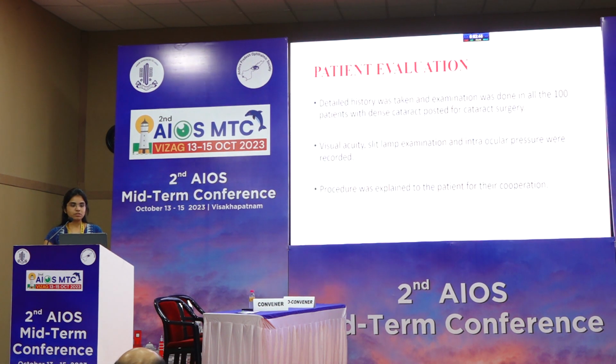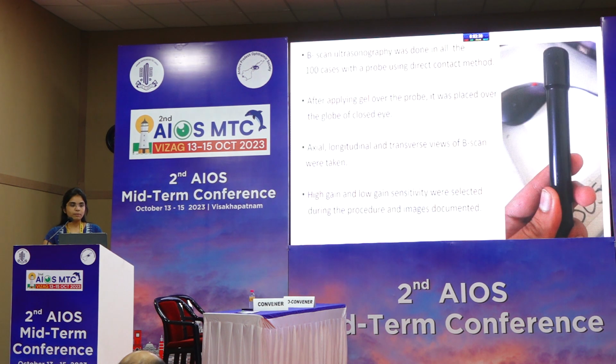Patient evaluation: detailed history was taken and examination was done in all the 100 patients with dense cataract posted for cataract surgery. Visual acuity, slit lamp examination, and intraocular pressure were recorded. The procedure was explained to the patient for their cooperation.